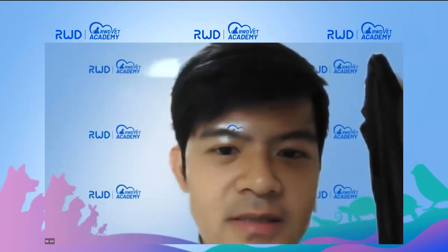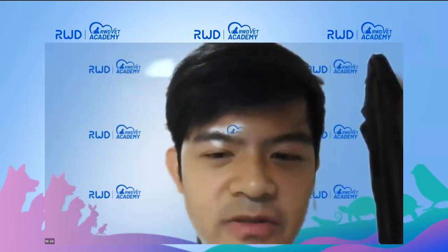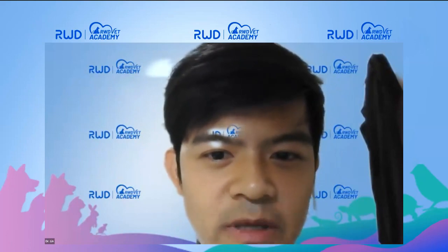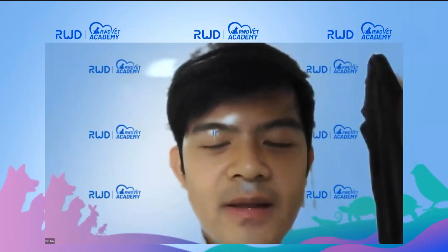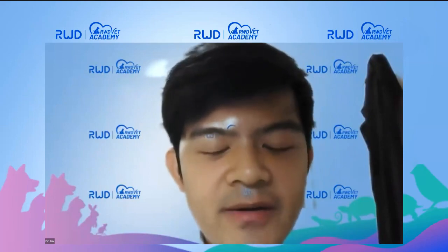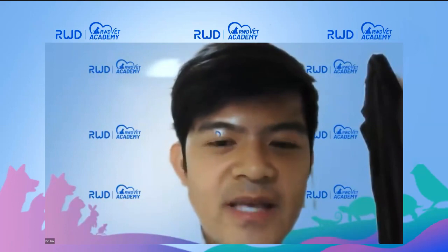The next one is, how many times should we do acupuncture therapy? In your case, you use once a week. What if we do it 3 times a week or more? In my opinion, the laser therapy will promote self-repair. So once we do the laser therapy, we need to give the body more time to repair itself.